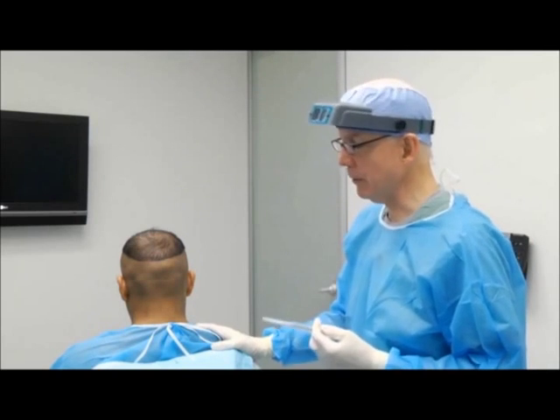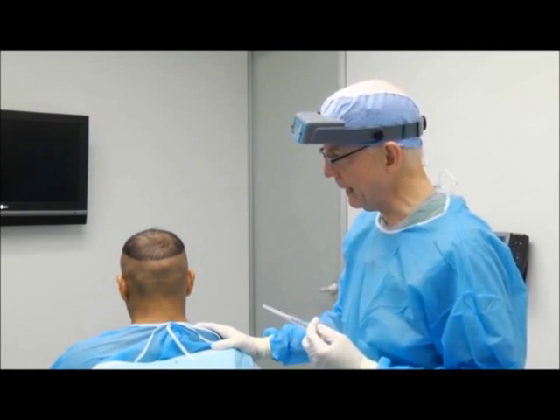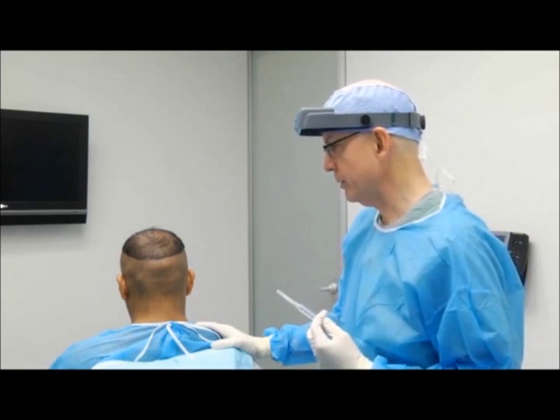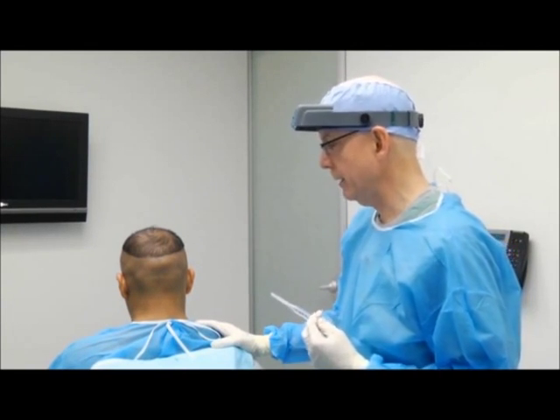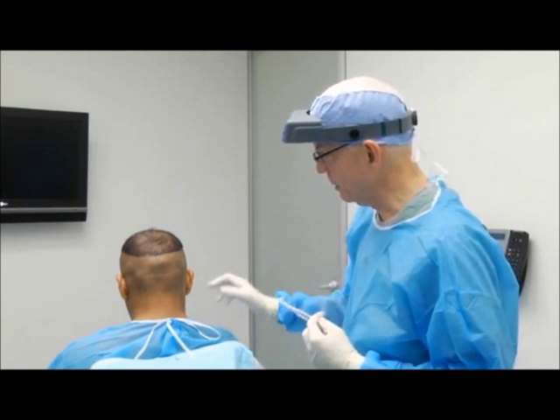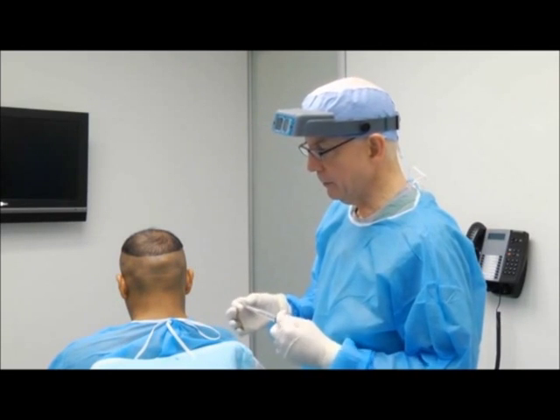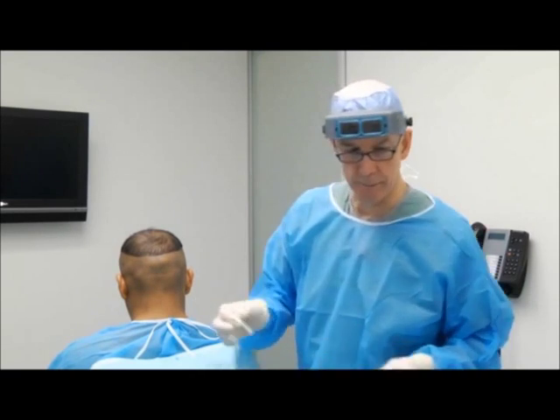We're going to give a ring block with local anesthetic. The anesthetic contains 0.5% lidocaine — we use about 60% of that — and 40% will be bupivacaine at 0.25%. We add 1 to 200,000 epinephrine. We'll go around the base of the donor area to make the injections a little bit more comfortable, and we'll use some vibration.